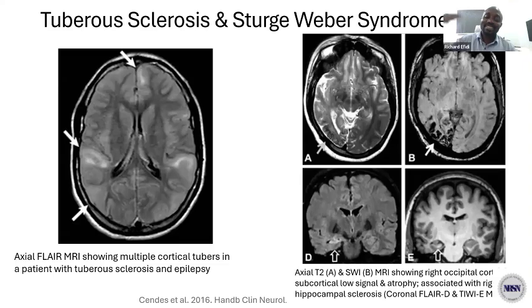It's meant to be done at a second level, especially if we are unable to diagnose focal epilepsy with structural MRI based on the HARNESS protocol by the International League Against Epilepsy Imaging Task Force. So if we are not able to conclusively detect the epileptogenic zone, then we can proceed to arterial spin labeling. It's not a routine modality because it's an advanced modality, but it can also be done as part of the MRI acquisition. No, I don't do it routinely in my center.